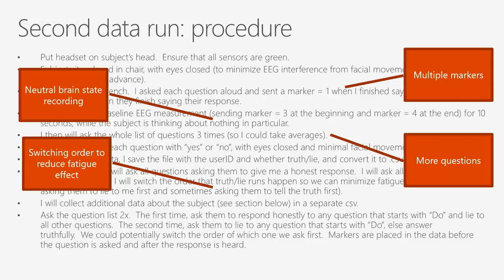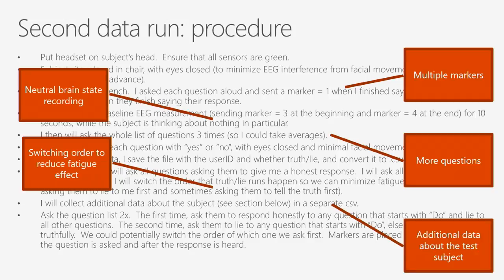Okay, so the next thing I did in here was I'm starting to collect additional data about the test subjects as well. So just some extra random things. I'm recording gender. I'm recording age.